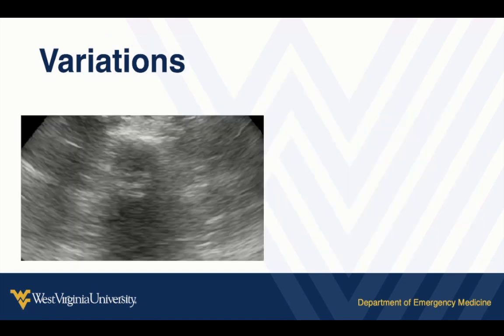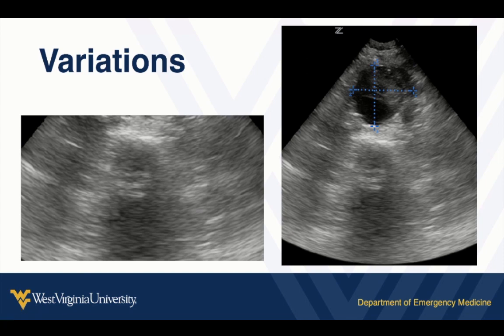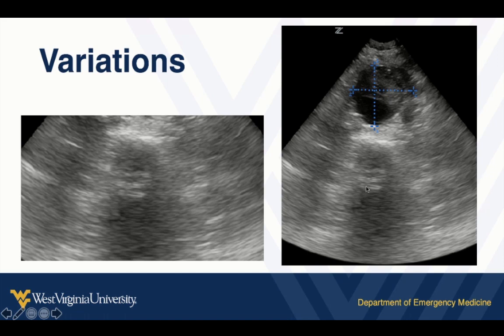One less common pitfall: if you're having trouble and focusing on the wrong spot, you may see something that looks like aorta. But what you're actually seeing is the intervertebral disc. As we scan through the spine, when we see the bony vertebral bodies we get a shadow, but occasionally we can see the outline of the intervertebral disc and the spinal canal with a shadow behind it — which could fool us for the aorta. Be mindful of your landmarks and what they look like as you scan down through the abdomen.